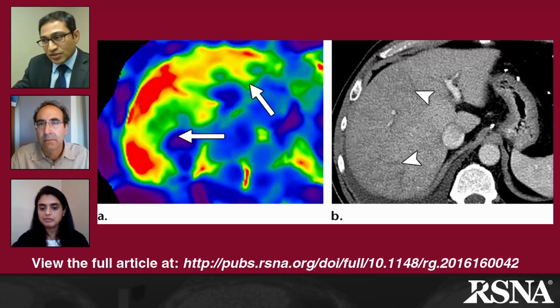So this information goes along with what we see on the imaging, which we probably didn't know what was happening, but we now have evidence that this is an area of passive congestion, and it leads to increased stiffness. I feel this kind of appearance can also be seen in primary sclerosing cholangitis, in which peripheral ducts are involved, and then these ducts will lead to fibrosis and stiffness in the peripheral part of the liver.